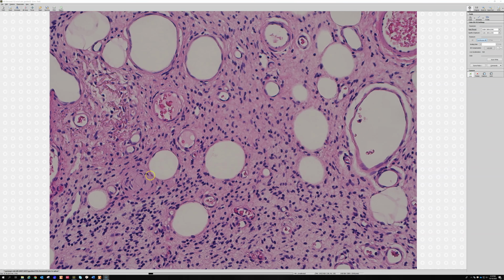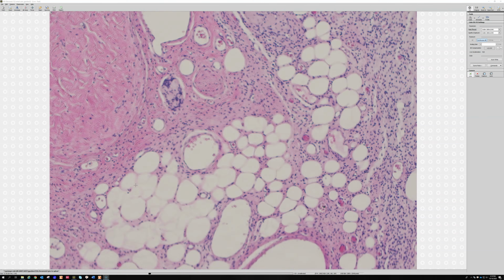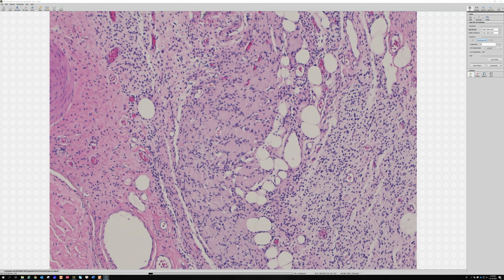Here's another one right here. And if you're watching from home, does this remind you of any structure you've seen elsewhere in the body, perhaps? And here's more of them. There's a whole cluster of them. Here's like 50 of them.